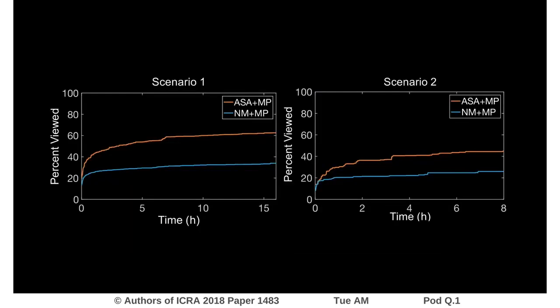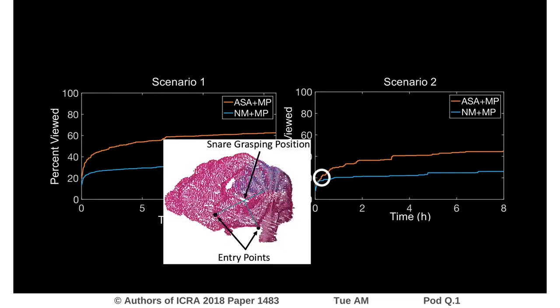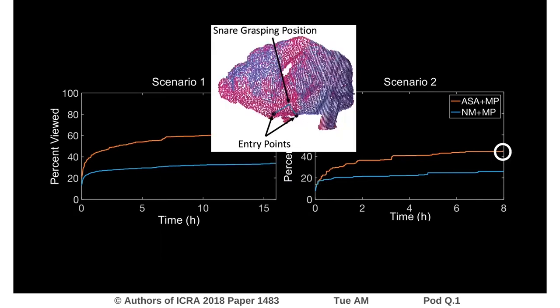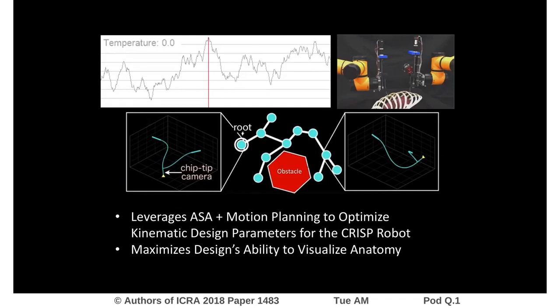In both cases, the method performs well, allowing us to go from designs that are able to visualize a small portion of the anatomy — such as is shown here for scenario 2, where the purple points are the visualized points — to designs which are able to visualize a much larger percentage of the anatomy, such as shown here. Our method, which leverages ASA and motion planning, allows us to optimize the kinematic design parameters for the CRISP robot, resulting in designs which are able to visualize a large percent of relevant anatomy.